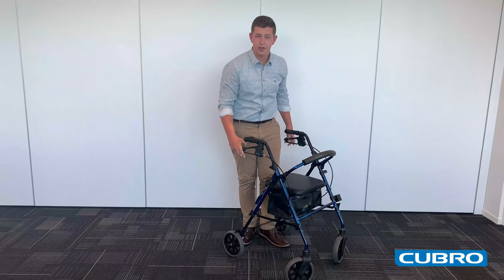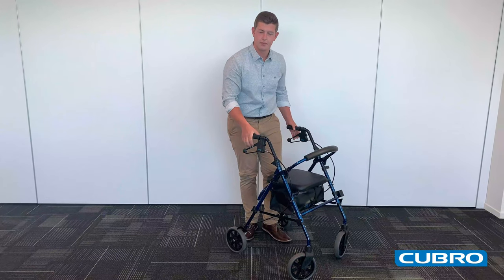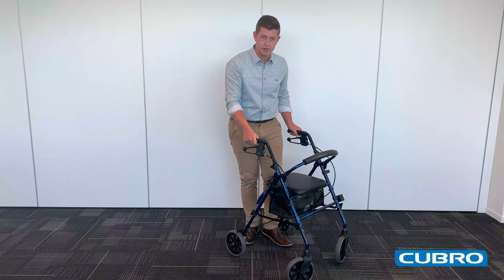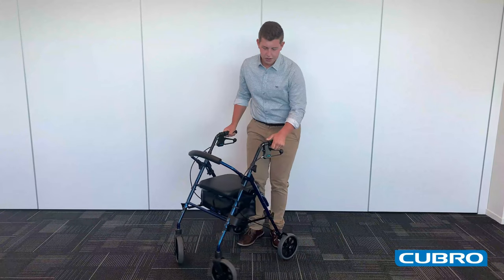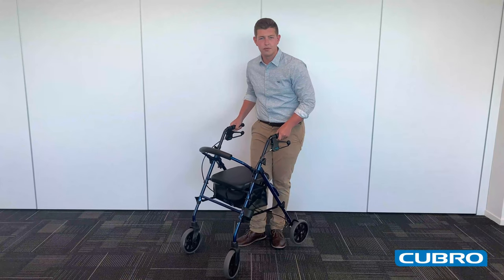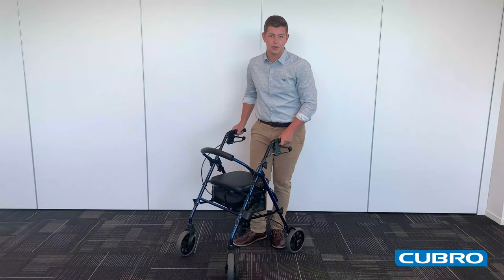Once again, you also get the one touch brake system, as well as the seven different adjustment points and the moulded hand grips. It also has an inbuilt cane holder and larger eight inch wheels, making it awesome for both indoor and outdoor use.